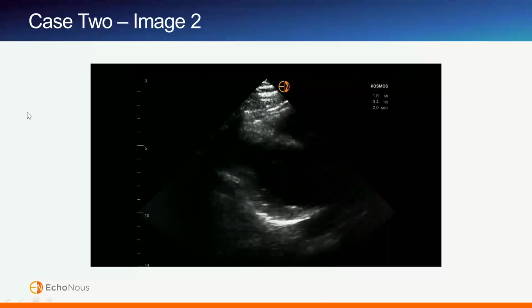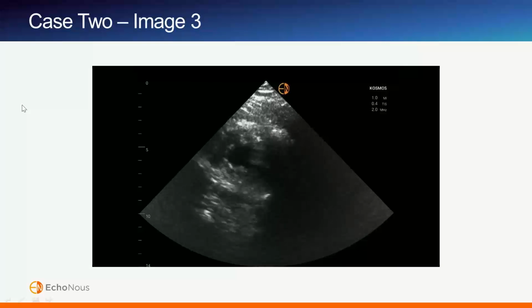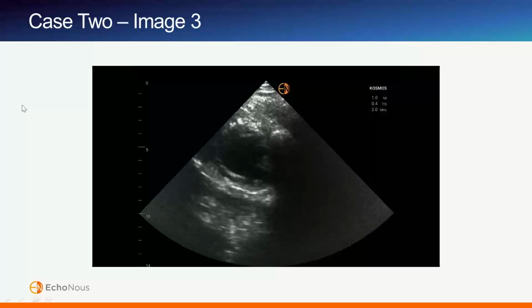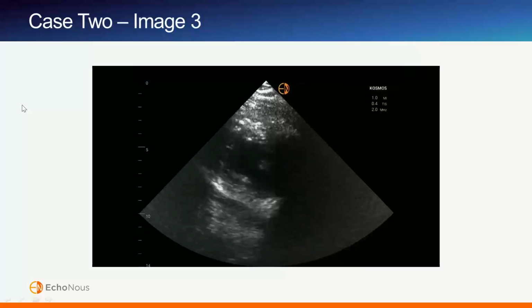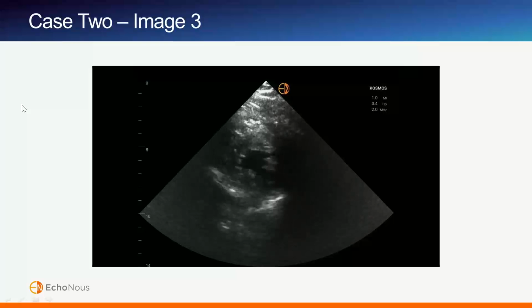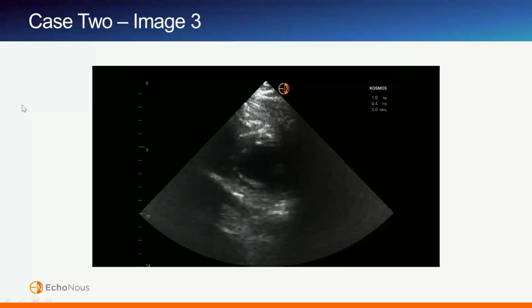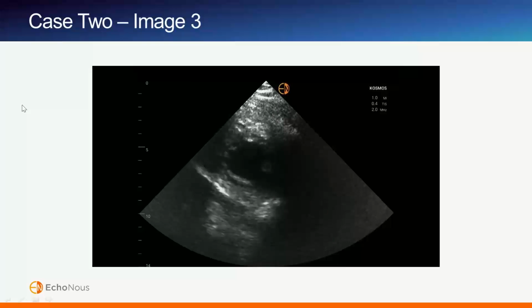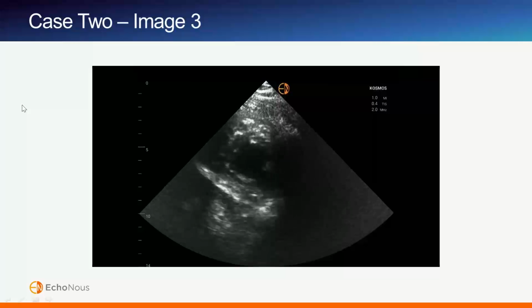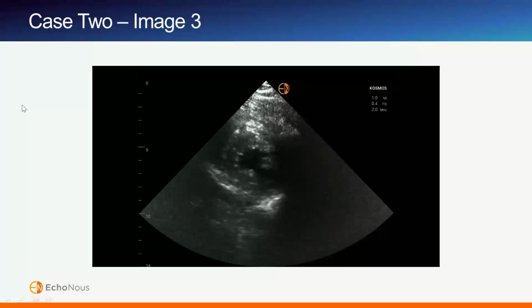And then going back to your parasternal short, you do see that nice donut for the LV, and you really can't even see the RV. If someone has a large RV, usually it's coming into the picture. Depending on where you are, if you're at the papillaries, you can come up a little bit and get more of that papillary, and then you can see the RV a little better. But I'm not really seeing the RV coming into the view too much, so that's also reassuring.